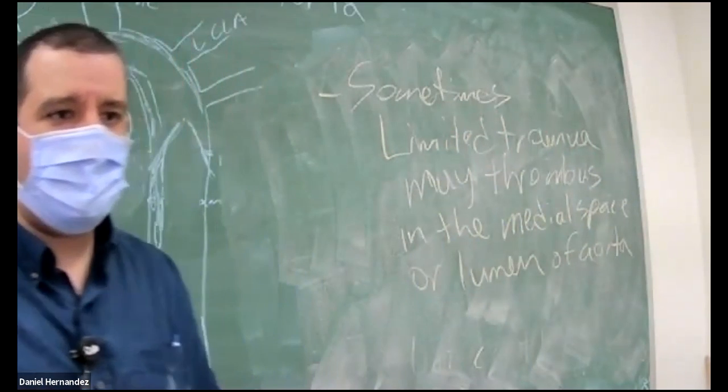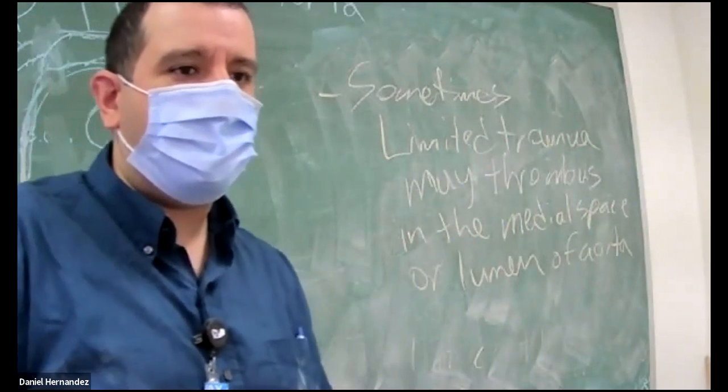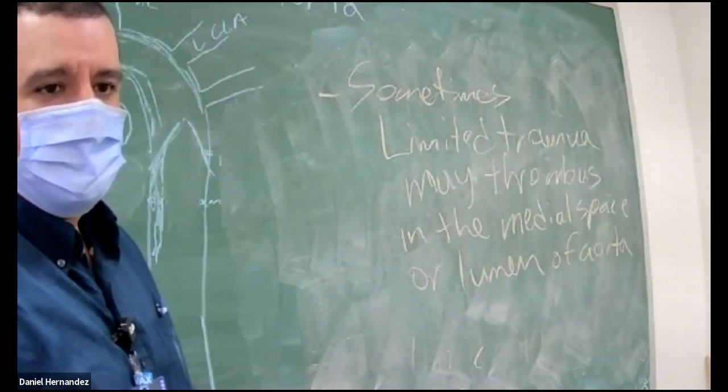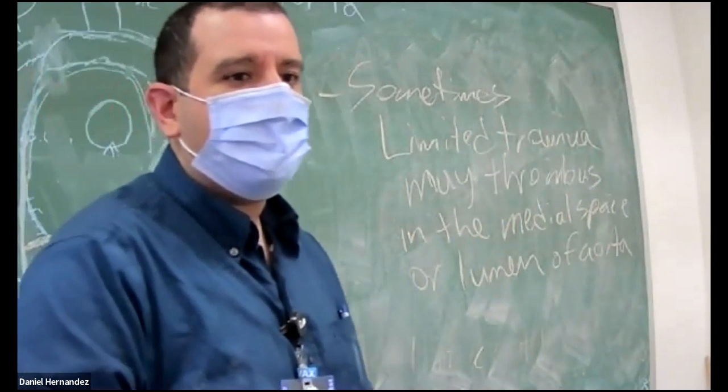So if this is noted in a young patient following trauma, thrombus should be considered over an atheroma.